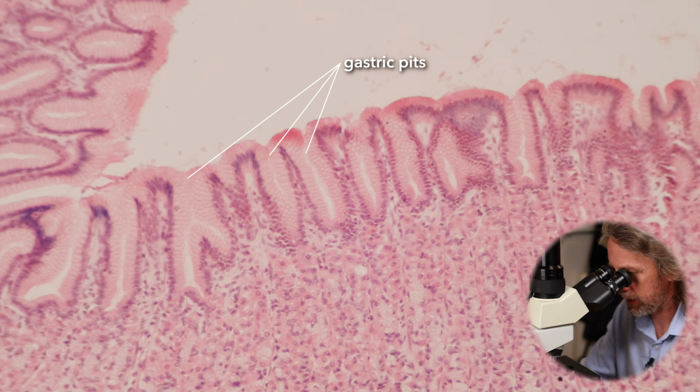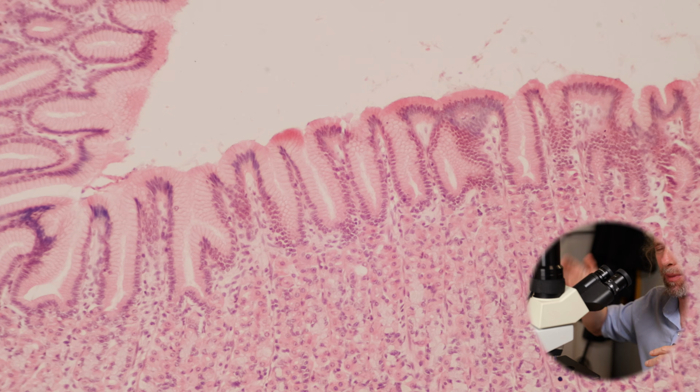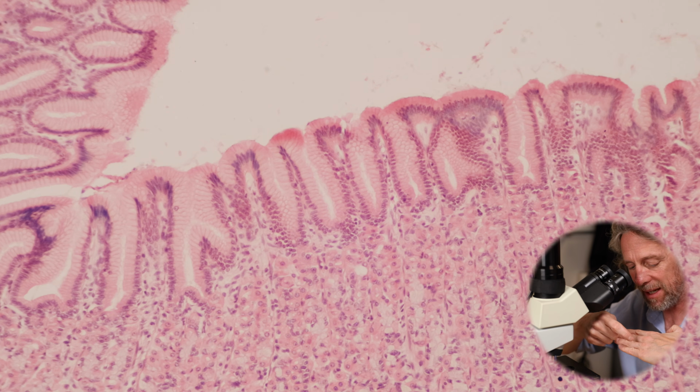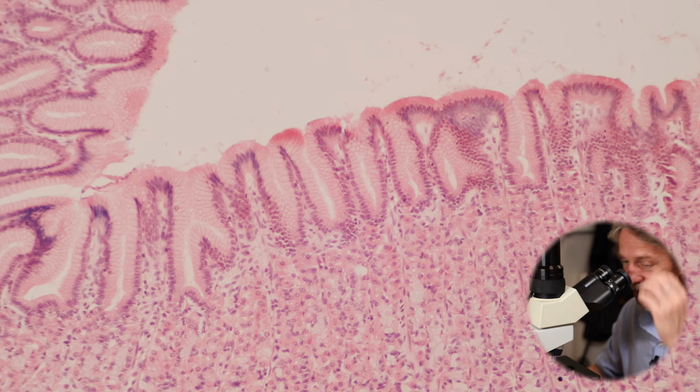So if you were looking at the surface of the stomach, like at the flat surface of the epithelium, I know the epithelium is actually very folded so the stomach can expand, but imagine you're looking at a flat bit of the epithelium, you'd see millions of tiny little holes in the surface of the epithelium inside the stomach, and those are the gastric pits. So there's a hole that goes into a pit, and that's what we're looking at here.